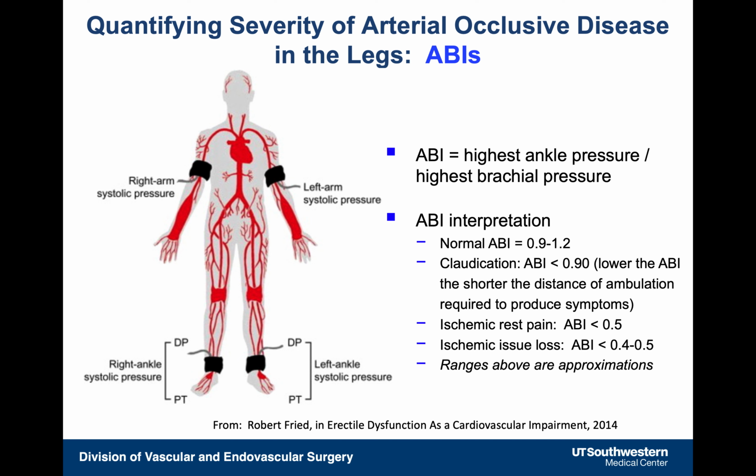And as we all know, many older people, for a variety of different reasons, ranging from degenerative joint disease to cardiopulmonary problems, don't walk that far. And so they actually don't know whether they would have claudication with an ankle brachial index of 0.85. As the ankle brachial index diminishes further, though, it's more likely that the patient will experience claudication at shorter distances.